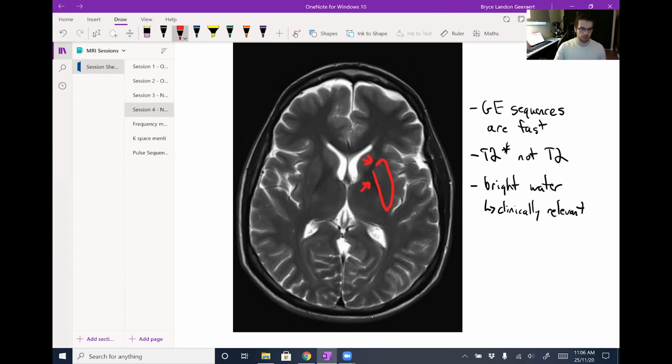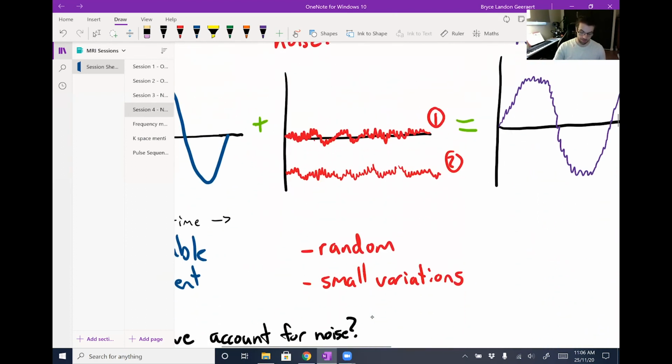With higher resolution, we are able to see those differences. They don't just get blurred into the same level of gray, but each voxel or pixel is more influenced by noise individually. So that comes back to voxel size and resolution. It's a trade-off, but you've got it exactly right there.